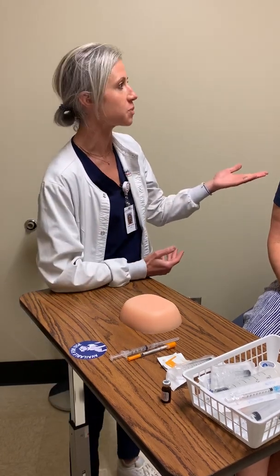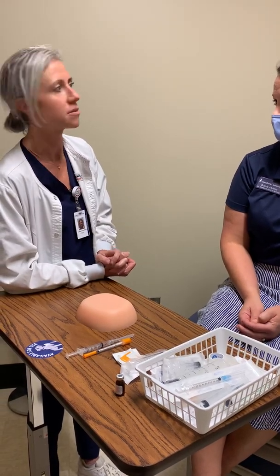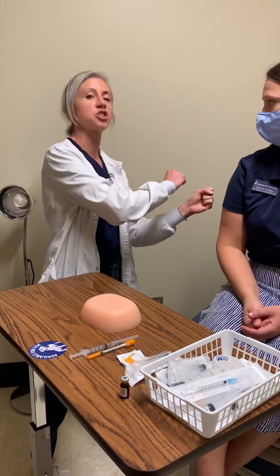So let's talk about another subcutaneous injection since we're here. Let's talk about insulin. We give insulin subcutaneously, okay? One of the big things that I always tell my students, and one thing that's very important, if Miss Mobley has been taking and giving herself insulin for the last 15 years, what can I do that would maybe make the procedure a little bit better for her? Miss Mobley, where do you like to give yourself your insulin? I usually do it in my belly. Okay, well, I'm going to give it to you in your belly then, okay? We love to prance in and say, I want to give you your insulin and shoot into the back of the arm.